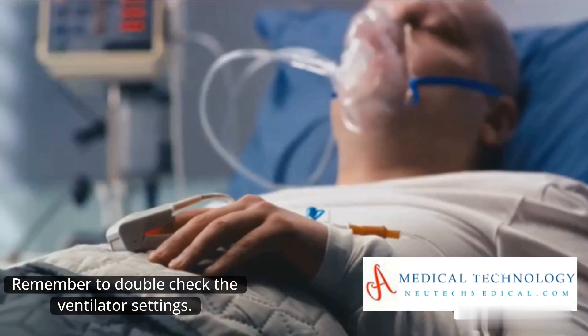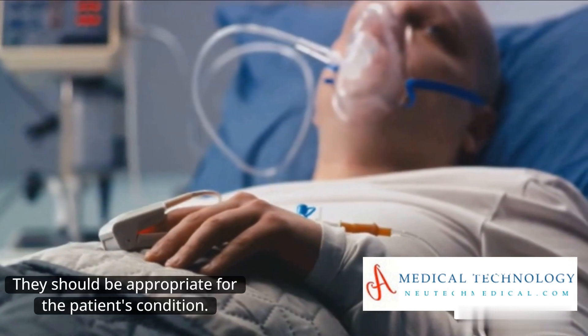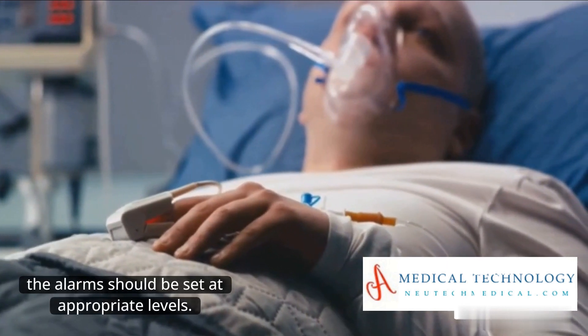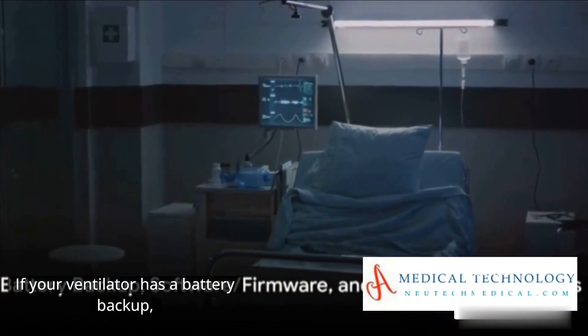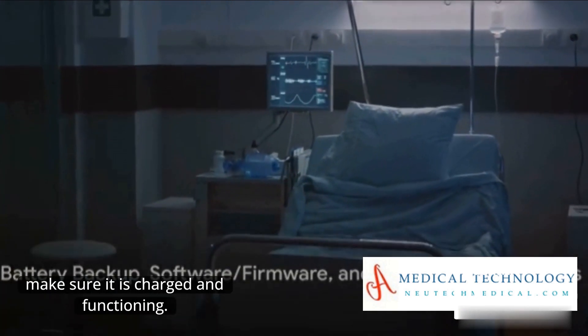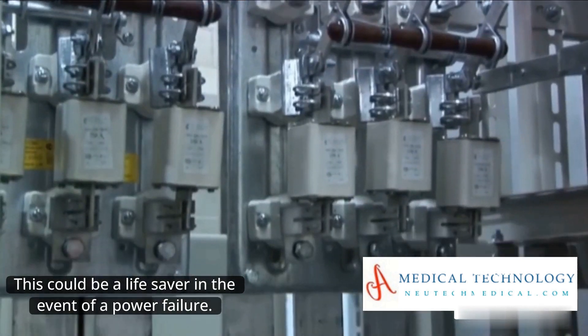Remember to double-check the ventilator settings — they should be appropriate for the patient's condition. Likewise, the alarms should be set at appropriate levels. If your ventilator has a battery backup, make sure it is charged and functioning. This could be a lifesaver in the event of a power failure.